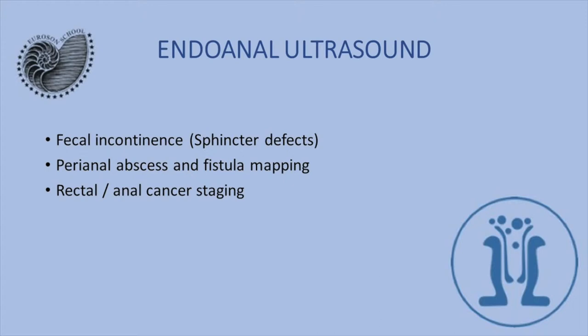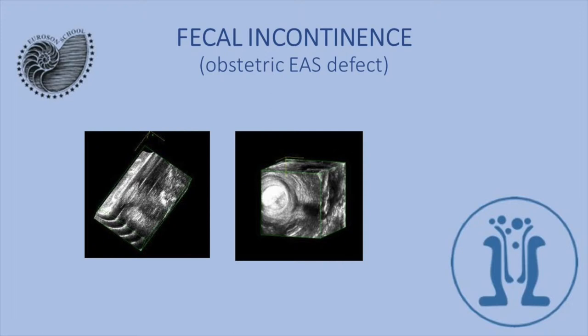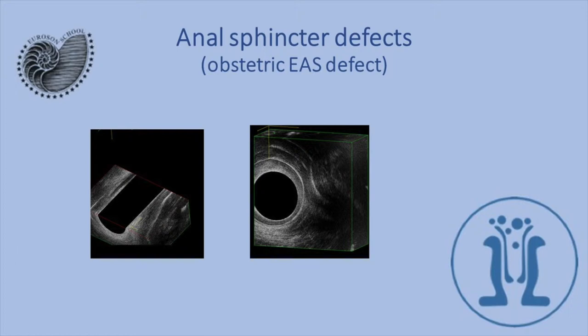Here we see an obstetric anal sphincter defect with a small fistula in a young woman. Here is the fistula, and we see that the sphincter is very small in the anterior position. Here we see with my finger inside the vagina that the anal sphincter is very small anteriorly because of a difficult delivery.